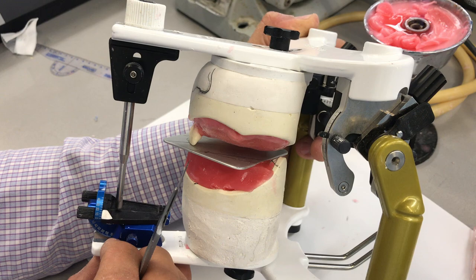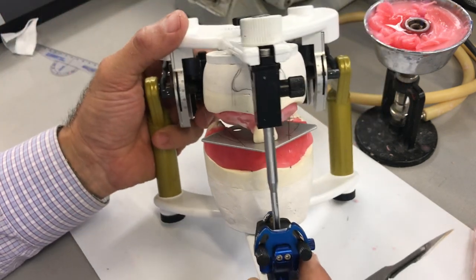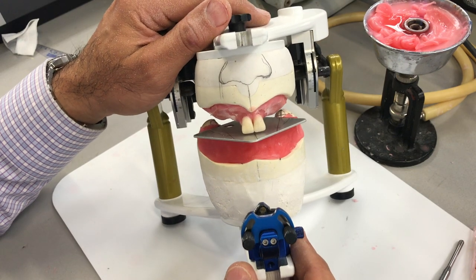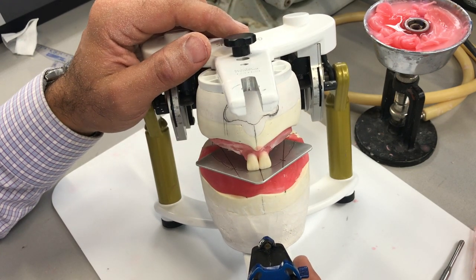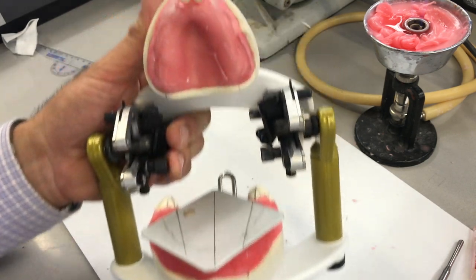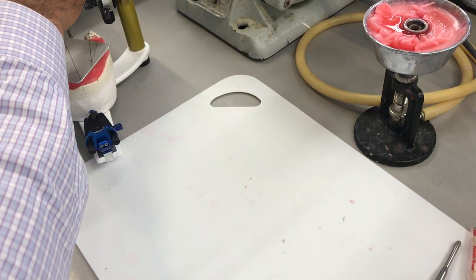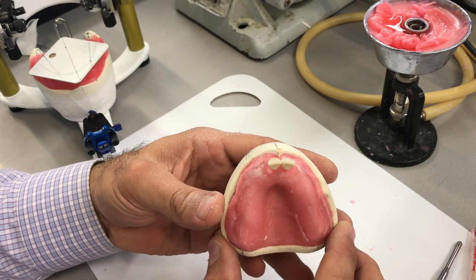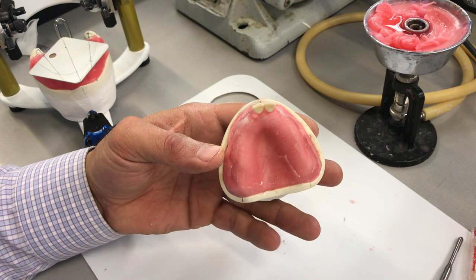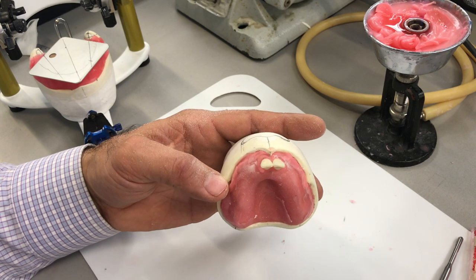When we look at it from a buccal view, the incisal third of the tooth is in a straight-up position and then starts to curve towards the ridge — same thing on the other side. Looking at it from a frontal view, I'm going to remove the pin just for a quick look. The long axis of the tooth, which is an imaginary line running between the middle third of the tooth, is pretty much straight up and down. From an occlusal view, I start to develop a sense of labial curvature, with the incisal edges matching each other.